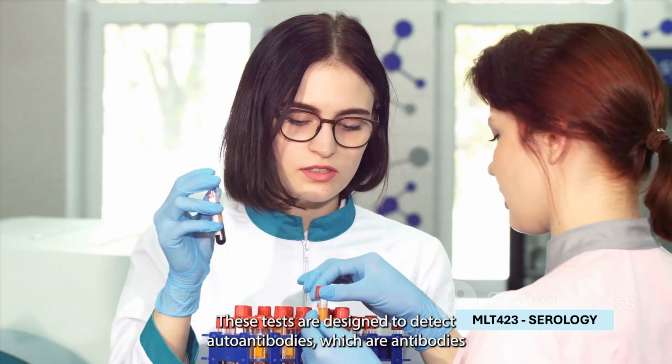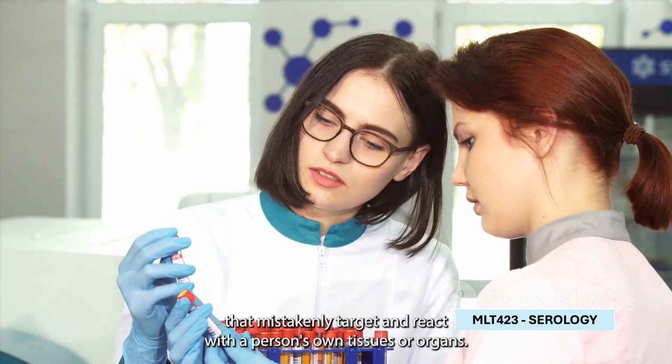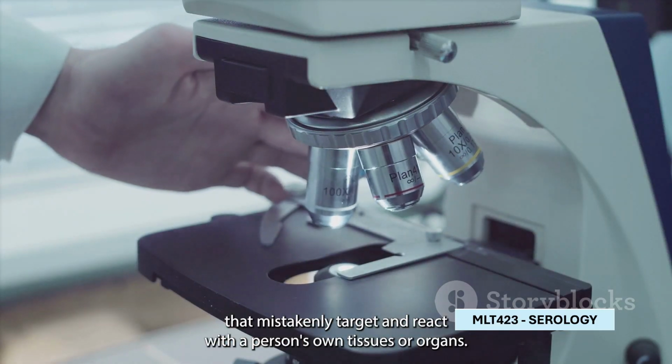These tests are designed to detect autoantibodies, which are antibodies that mistakenly target and react with a person's own tissues or organs.